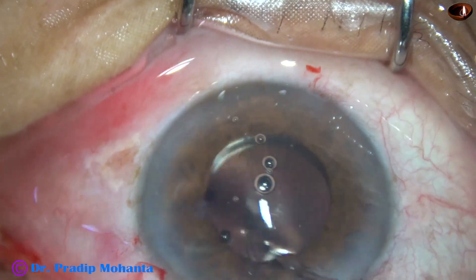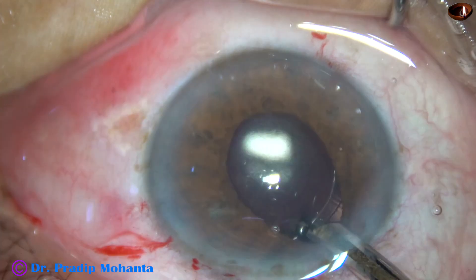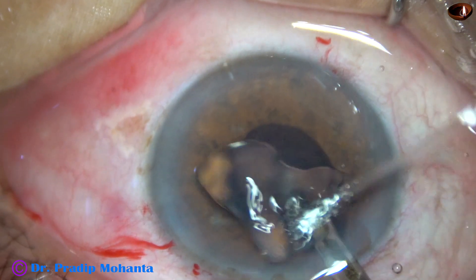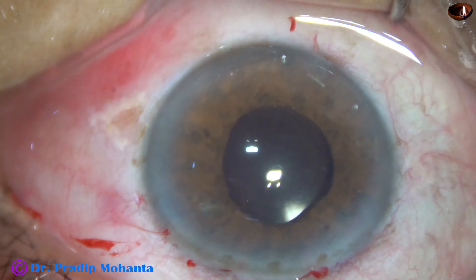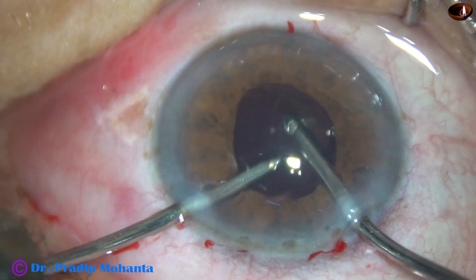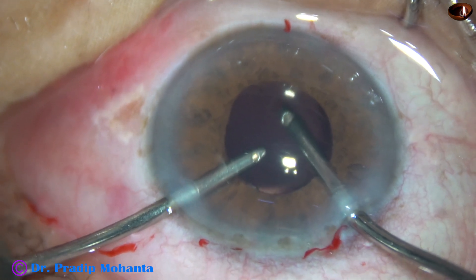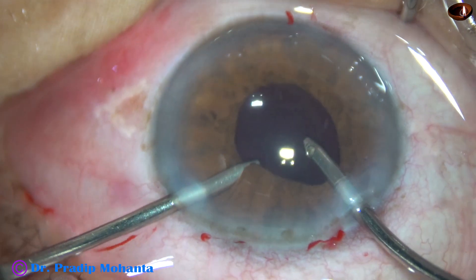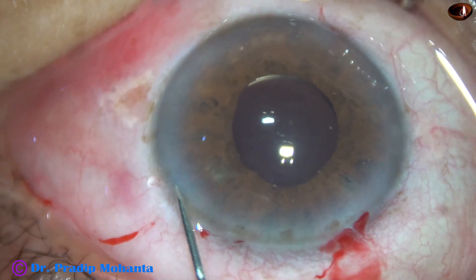Now is the time to remove the visco used for implantation of the intraocular lens. Since the iris is floppy, whenever I try to remove visco and there is some irrigation pressure, the iris tends to prolapse through the main wound. So the ideal pupil expansion device in cases of severe floppy iris syndrome is iris hooks. If we use a B-Hex ring, there is a possibility of disengagement of the ring at some steps of the surgery.